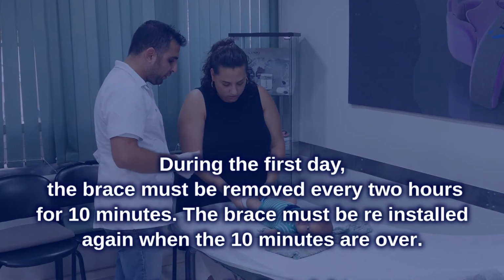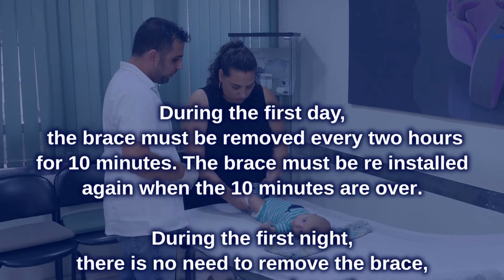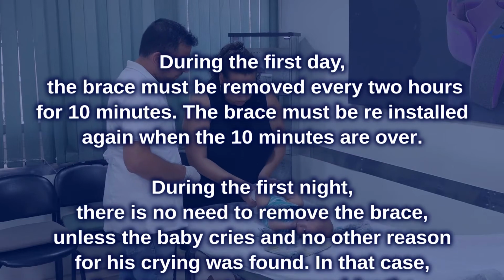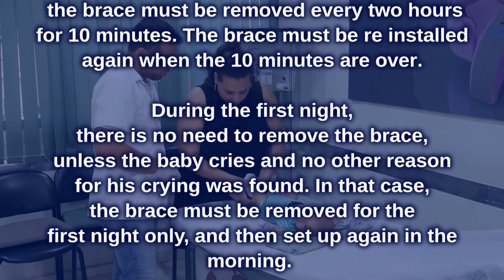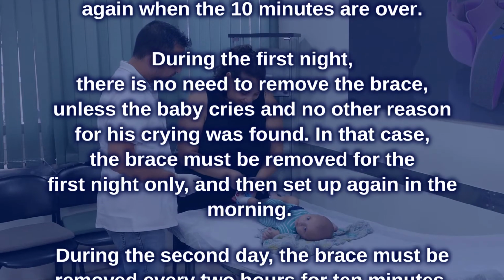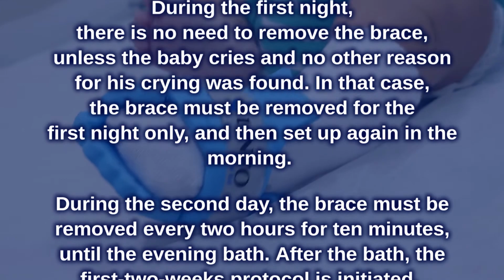During the first day, the brace must be removed every 2 hours for 10 minutes. The brace must be reinstalled again when the 10 minutes are over. During the first night, there is no need to remove the brace unless the baby cries and no other reason for his crying was found. In that case, the brace must be removed for the first night only and then set up again in the morning.